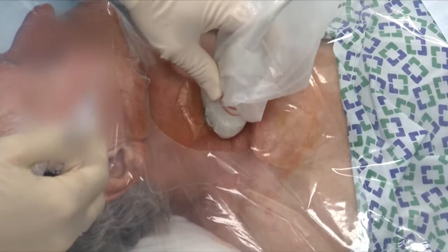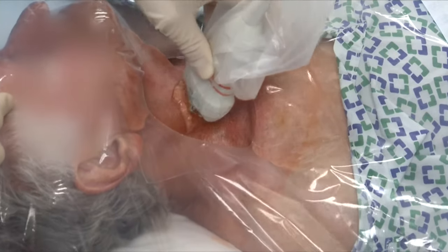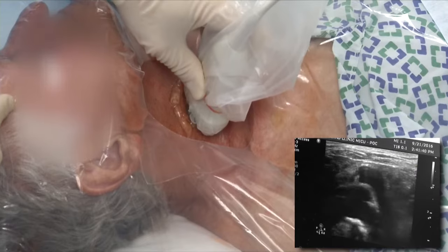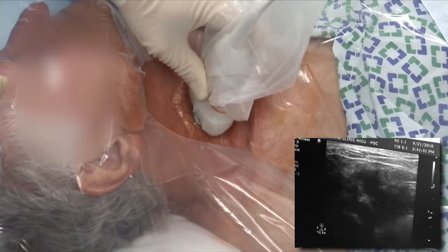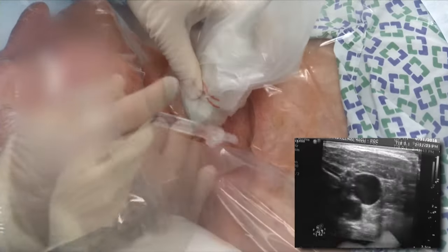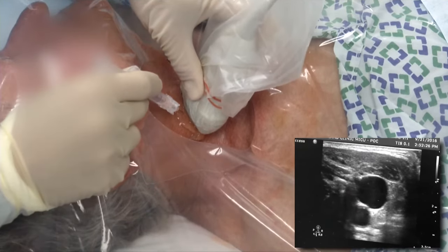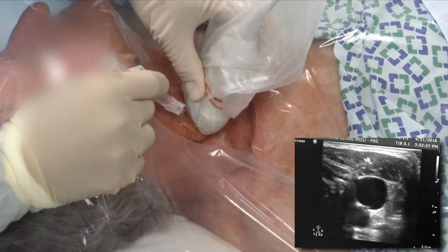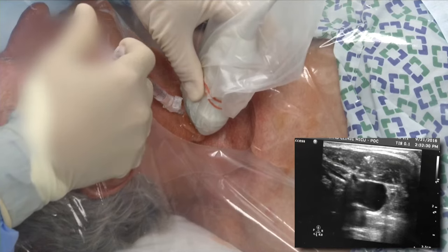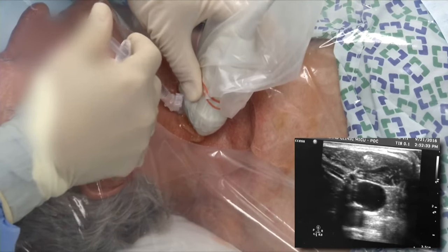Using a vascular ultrasound probe, the internal jugular vein is again identified. Under real-time ultrasound guidance, a 25-gauge needle is inserted into the subcutaneous space and 1% lidocaine is injected, taking care to avoid vessels.